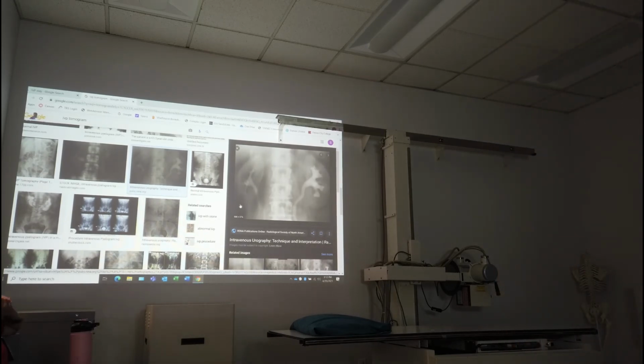Alright, so let's do some positioning. Now the positioning test is really easy. It's going to take you about 5 minutes.